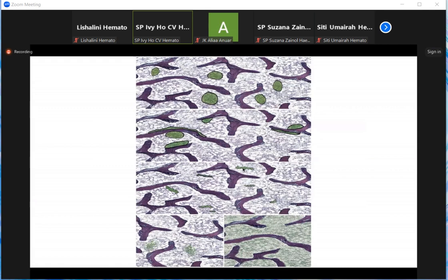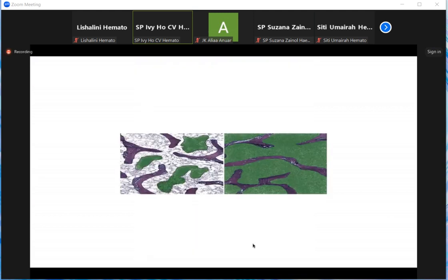These are the different patterns of distribution, like this one, lymphoid aggregate in the center of the marrow spaces. This one is nodules, close to or stuck on to the bone, and they can be in linear form as well. This one is intrasinusoidal, in the sinusoids. This one is interstitially distributed in the marrow spaces. It can come in irregular large nodules, or diffusely infiltrate, filling and jam-packing the marrow spaces.